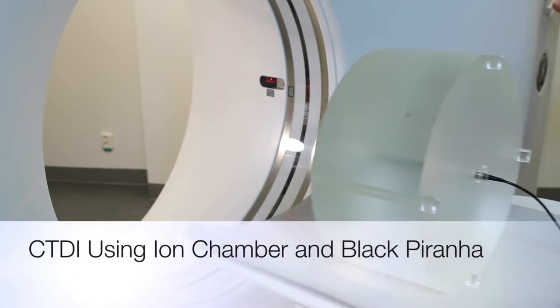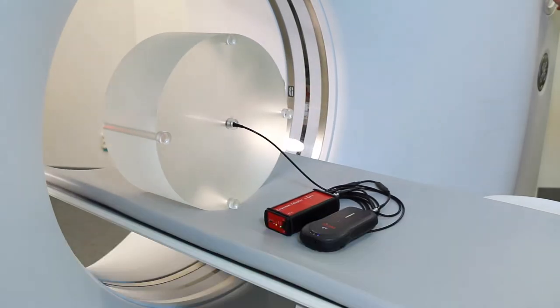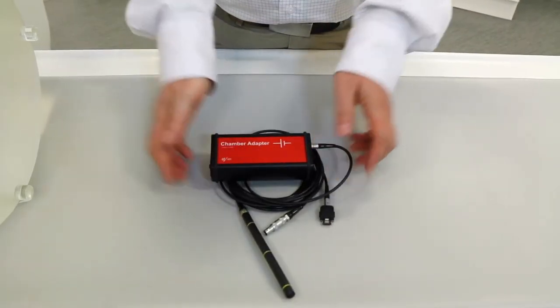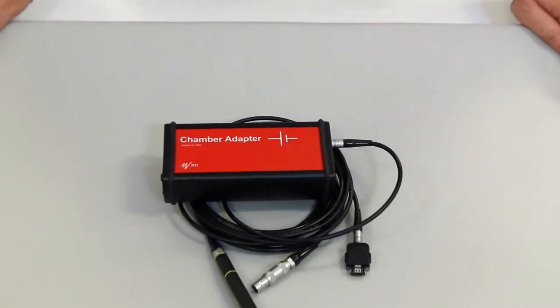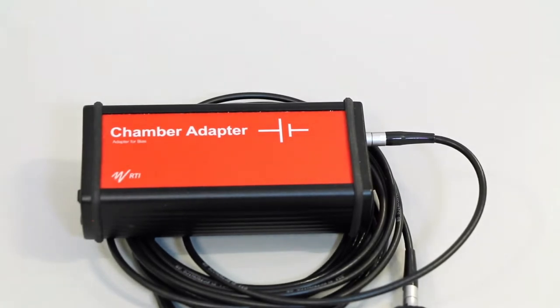In this instructional video, we will show you how to make a CT-DI measurement using a CT-Ion chamber and a piranha. Ion chambers require bias voltage, therefore you need our chamber adapter connected between the ion chamber and the piranha. With the chamber adapter, you can use a variety of different ion chambers together with the piranha.